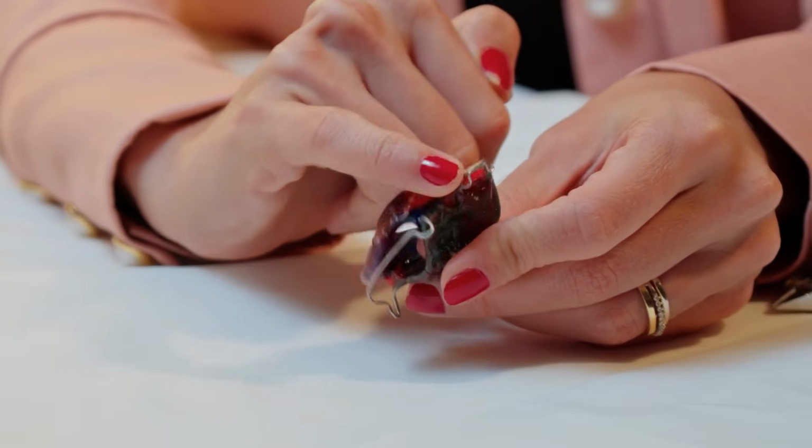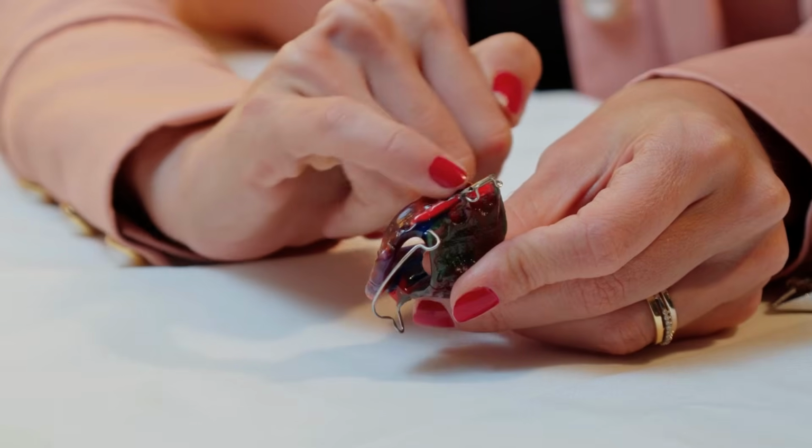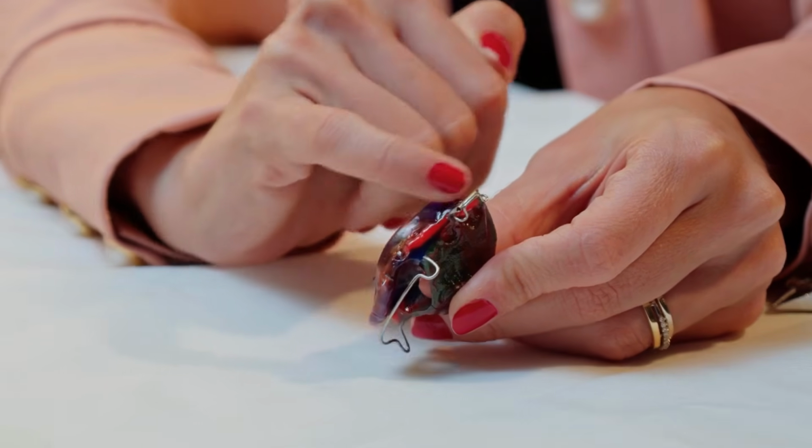This upper arch, which in a class 2 pattern patient is generally atresic. So I position the patient's tongue very well, and I also perform expansion and advance the mandible, having enough posterior acrylic to be able to grind it down and also correct the deep bite.